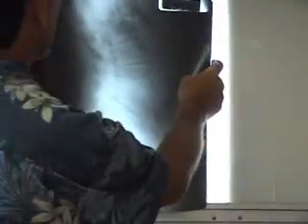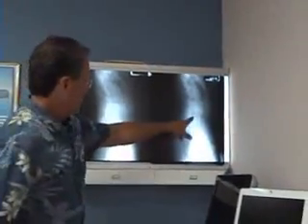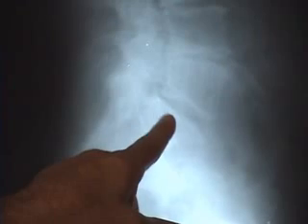What I really was impressed with, but I didn't get to compare them in the dark room, was the side view, which came out great. This is called spondylolisthesis, where this slips forward. That's actually, it's still slipping forward, but less, which is very remarkable. Really? Like they almost never go backwards. Really? Yeah. That's really good.